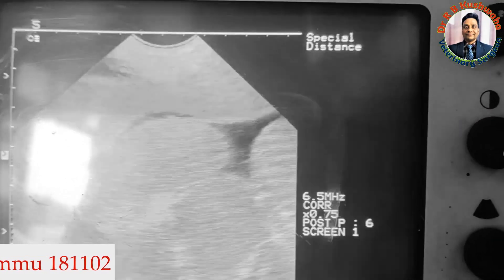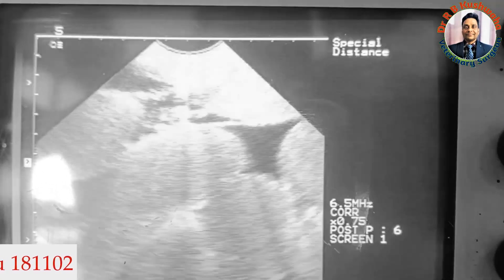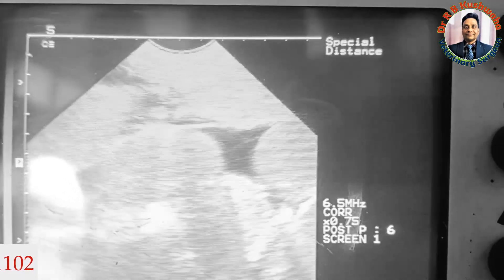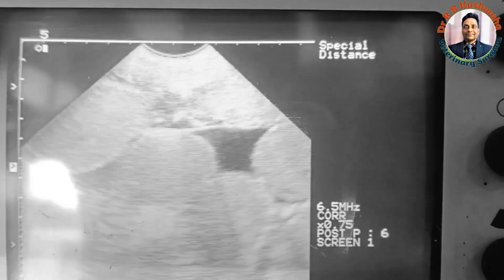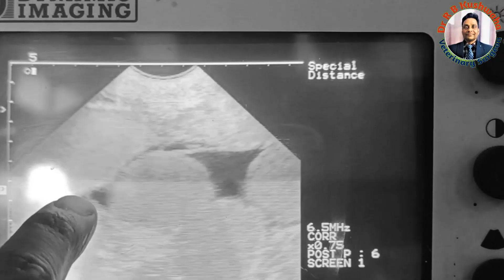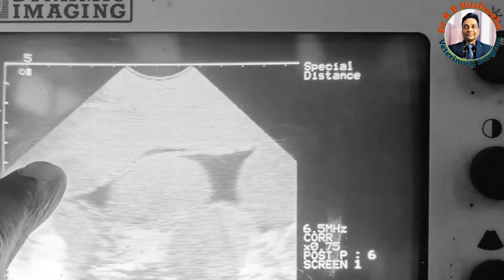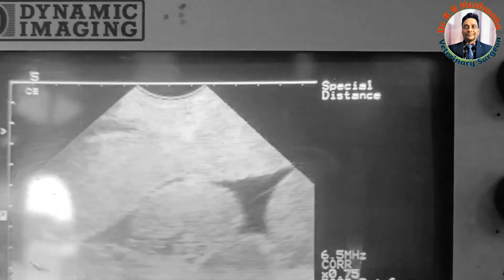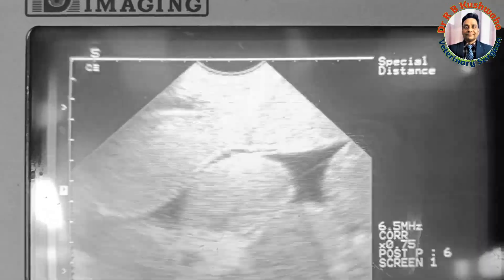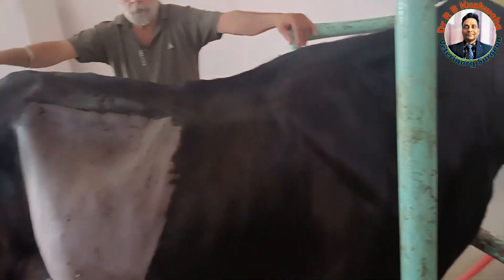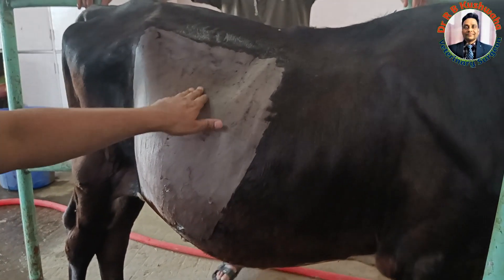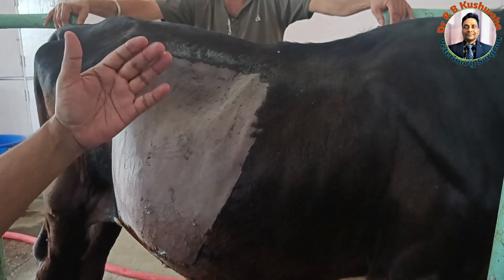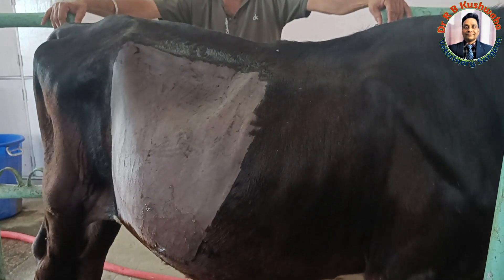You can see here that fluid is also present in the peritoneal cavity. This is the fluid, this is the free fluid, and you can see the passive flow of the intestine. So now we will go for a right flank laparotomy, perform the laparotomy, and then exteriorize the intussusception mass.